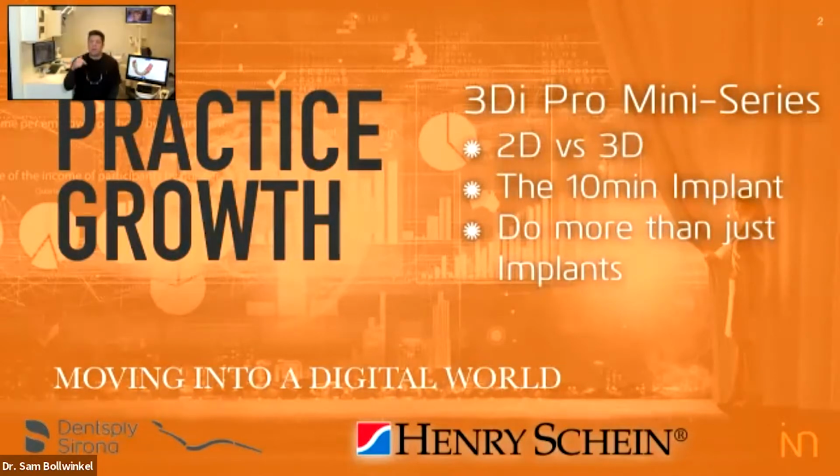So we want to see what other revenue streams, what other processes, and how powerful that cone beam can be to a practice. If I'm going to be incorporating that into my practice, we challenged you last week with an exercise of conceptually looking at, okay, I've already decided to purchase a cone beam. What does that mean to my practice? Was it a good decision? We evaluated ROI. We evaluated the CEO concept, that as a dentist, you are CEO of your dental practice. As you make financial and investment decisions, how can you grow and have a more successful practice? Team integration, that whole concept.